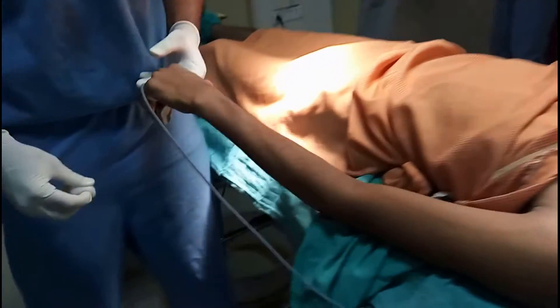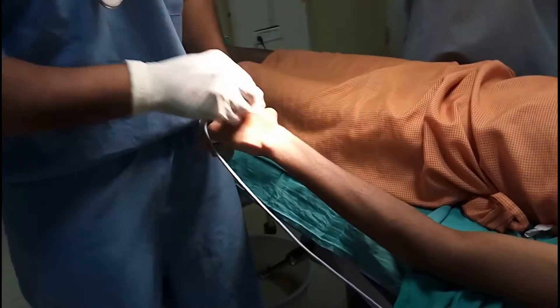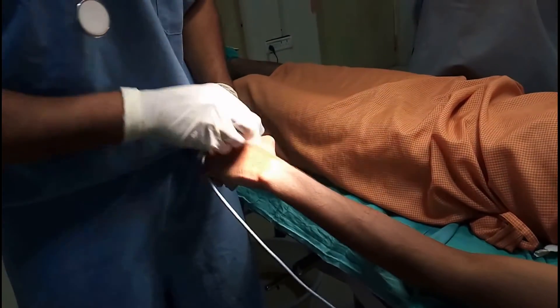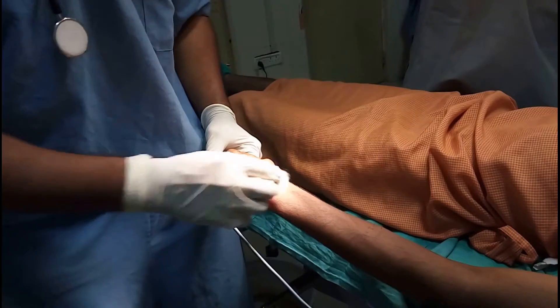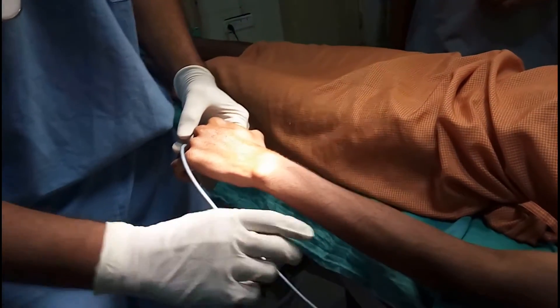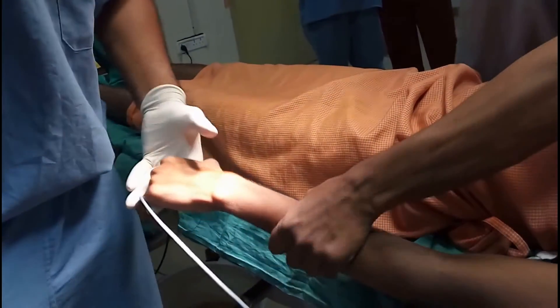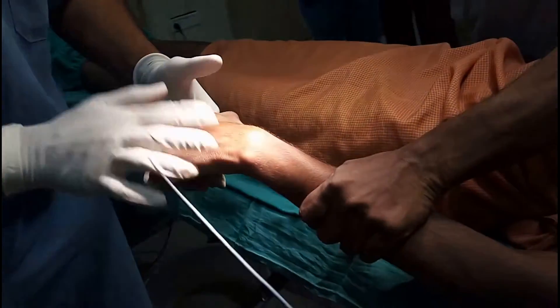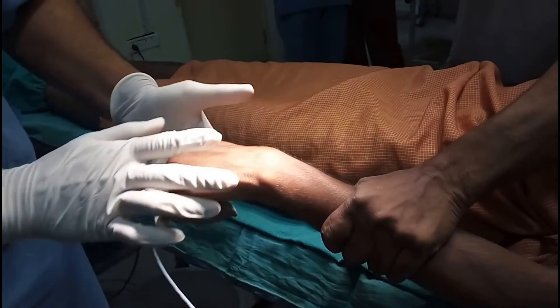Patient preparation is imperative to proper cannulation. A few sweeps on the skin in the area where you are going to cannulate. And if you do not have a tourniquet, you can always have a volunteer holding it up. Tapping the vein exposes it much better because there is release of histamine.